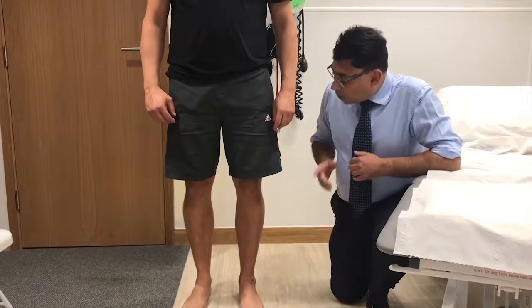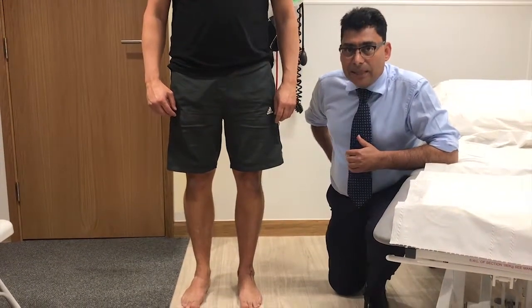Hello, I'm Manish Bhatia, orthopedic foot and ankle surgeon. Today we are demonstrating the technique for ankle injection using an anterolateral portal. The main indication for anterolateral ankle injection is anterior impingement of the ankle. We are now going to demonstrate the clinical tests for anterior ankle impingement.